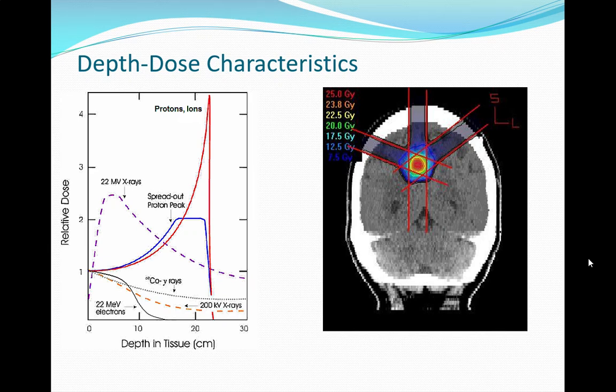The neat thing about these, if you look at the Bragg peak, you can see it comes in. And what's the basic idea here that's happening? When it's coming in, we're up in the 300 MeV range for most of our stuff. Right? 200, 300 MeV. These are traveling at a significant fraction of the speed of light. Right? They are traveling so fast. The way they interact is with that electron shell. Right? The electron shell is attracting them, ion coming in, so you get some bending, some curvature.